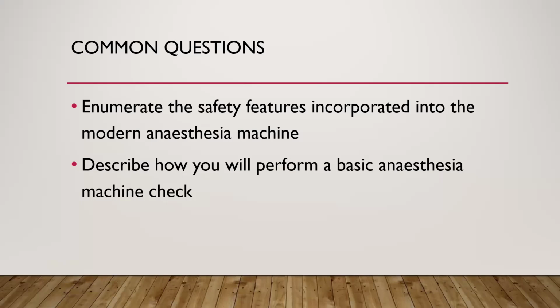Oxygen down. Pin index system, number 3. The diameter index system, number 4. Corrugated oxygen knob on the flow meter, number 5. Anti-hypoxic guard.